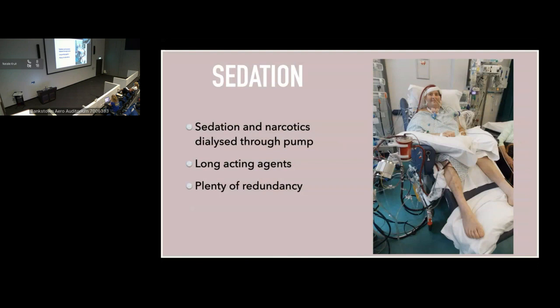In terms of your sweep gas flow, we normally set it at 2 litres and we progressively increase that over time. We don't want to reduce the PCO2 too quickly, particularly if you're starting with a PCO2 that's quite high. And that's just because the changes in CO2 will change the cerebral vascular tension, and the rapid changes in the vessel diameter can cause shear stress and micro tears.